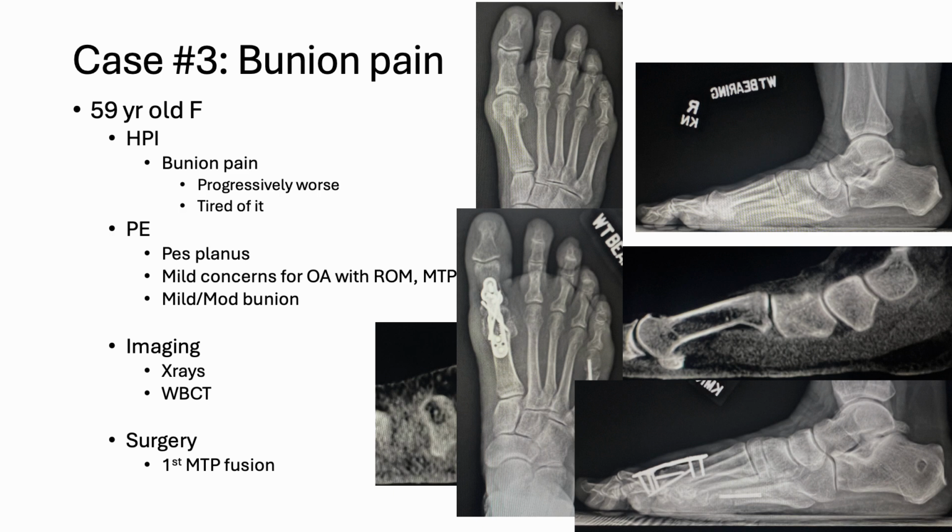If you look right here, I usually do a calcaneal bone graft harvest when I'm doing a big toe joint fusion, and I use the OsteoAuger from Arthrex. Again, I'm an Arthrex user. Not that you guys have to use Arthrex products, but that's the company I use when I'm doing this type of stuff.